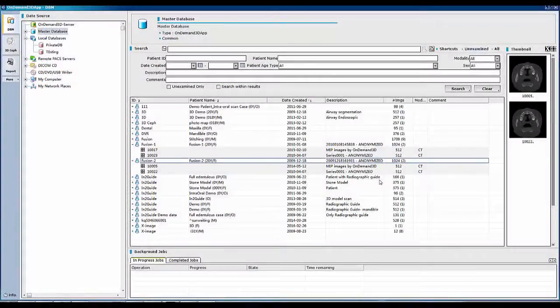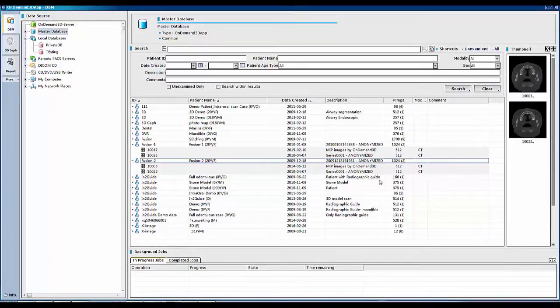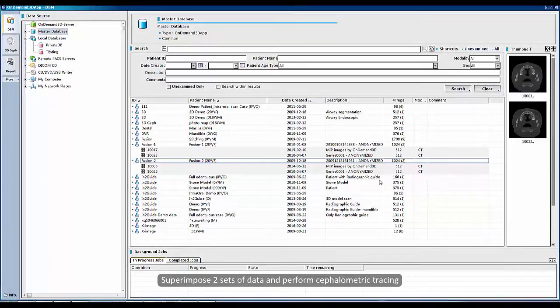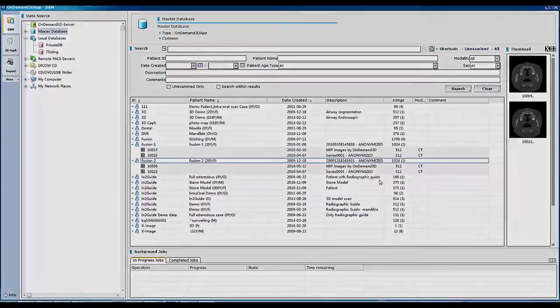Welcome to the video tutorial on on-demand 3D software. This video will cover the 3D Ceph module, particularly to superimpose two sets of data and perform cephalometric tracing.